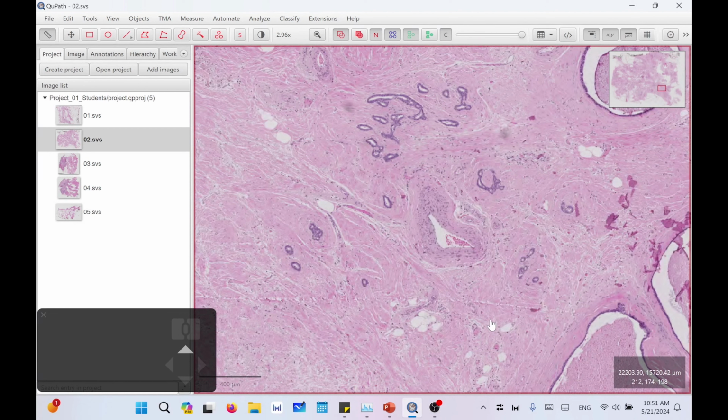So it will be tedious for us to annotate the whole slide image, and assume you are getting big data, for example, 10K patients or 10K whole slide images. It will take longer to perform manual annotation for the whole slide images. So we can annotate different parts from different patients and then provide these annotations to a model that can automatically annotate all of these whole slide images.